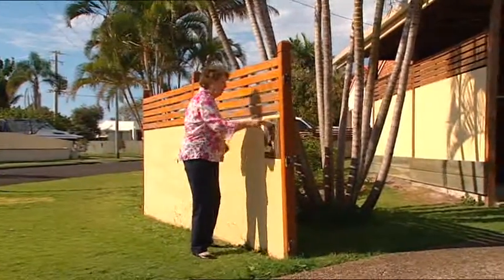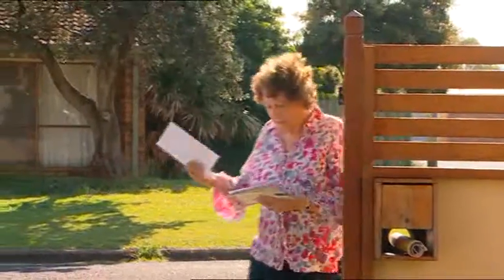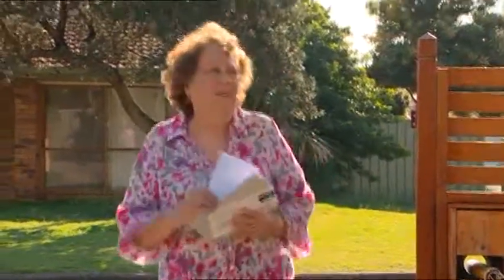Long-time sufferer of osteoarthritis and osteoporosis, Jill used the thermocyclopad to assist in the recovery of her double knee replacement.